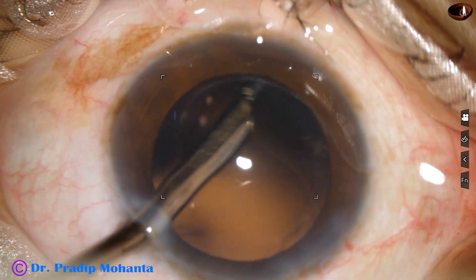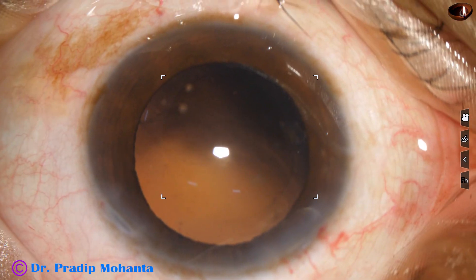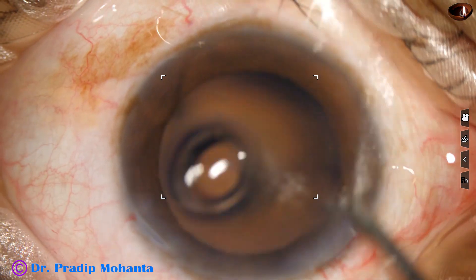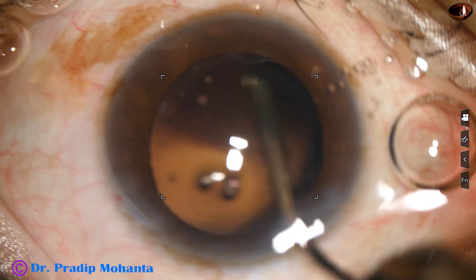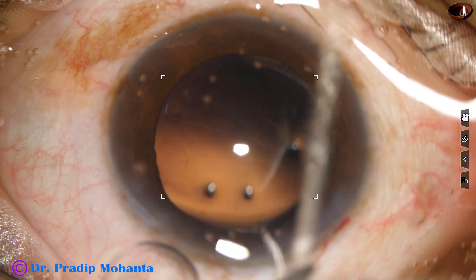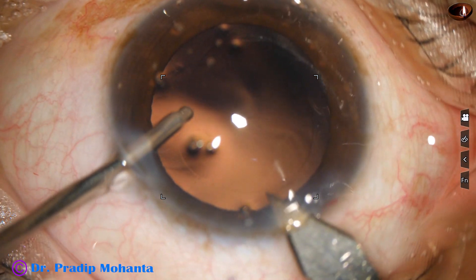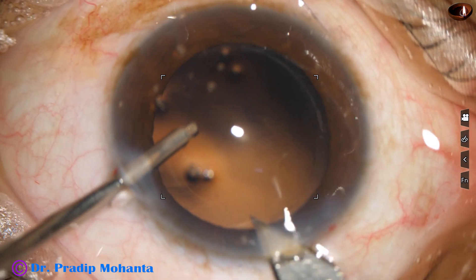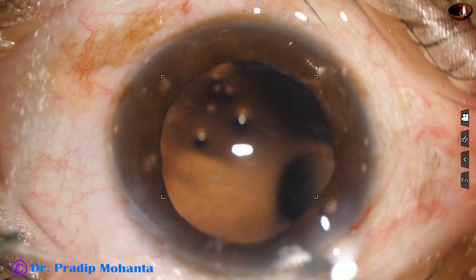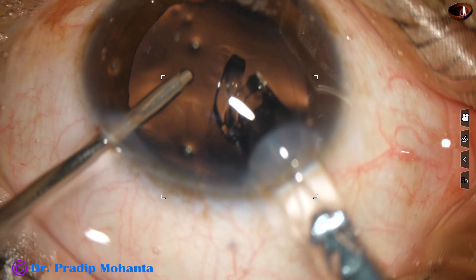The cortex is being removed by this Simcoe cannula. And now is the time to implant an intraocular lens. I'm going to use a B cartridge, so I'll enlarge the main incision a little bit — from about 2.8 millimeters to about 3 millimeters. And this is hydro-implantation of a single-piece monofocal intraocular lens.